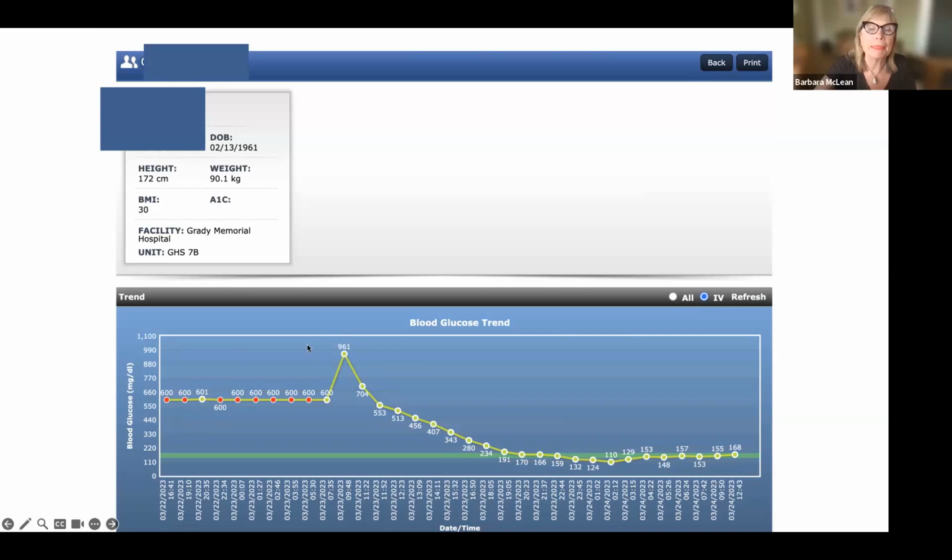And then, I'm pretty sure, a provider looked at it and said, this isn't adjusting. How come you're on the same insulin rate? That means you don't understand the Glucommander. Glucommander is only going to adjust every 4th blood glucose when you're above meter max, because we cannot do a real-time right now true evaluation of your blood glucose. That's a limitation of the glucometer.